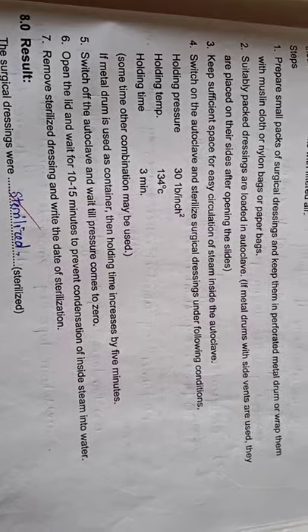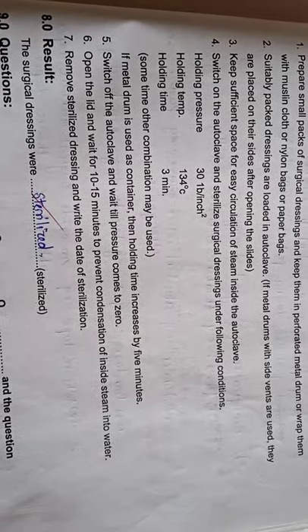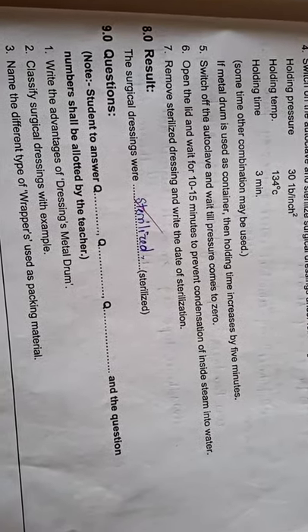If a metal drum is used as the container, the holding time increases by 5 minutes. Switch off the autoclave and wait till the pressure comes to 0. Open the lid and wait for 10 to 15 minutes to prevent condensation of steam into water. Then remove the sterilized dressing and write the date of sterilization on the container. Open the metal drum only when you want to use the surgical dressing, and close it again immediately.